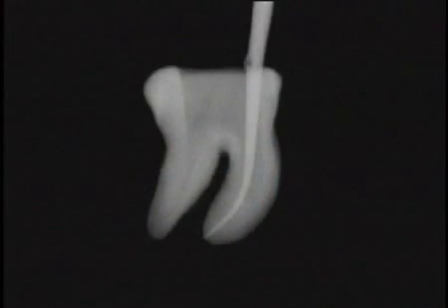Recall the X-ray before we started, noticing the significance of the ledge, and it's great to see after deep shaping, cones slide to place and to length.